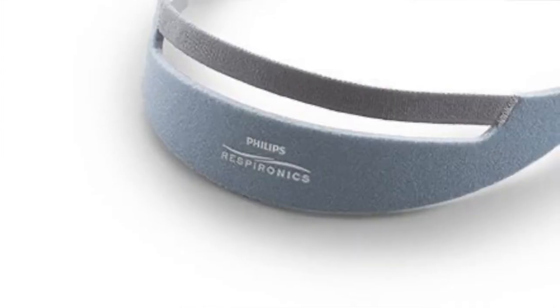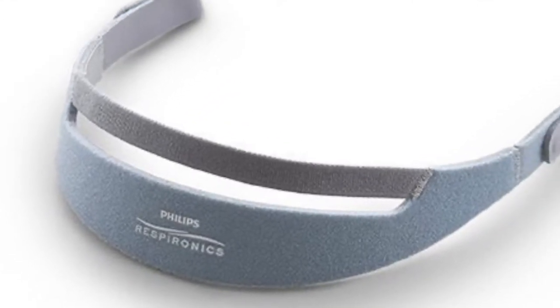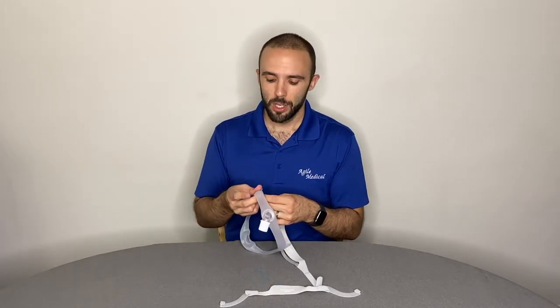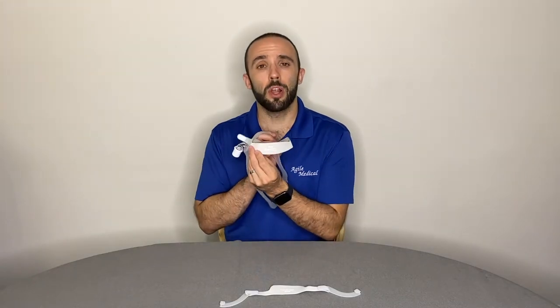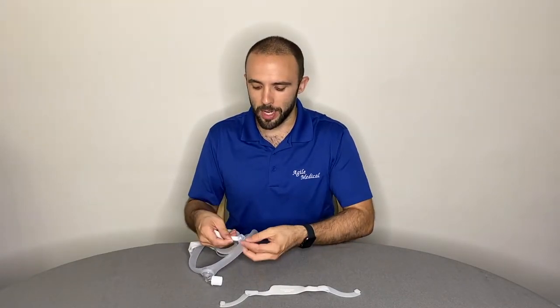Here's how it works. For the original model, simply slide the velcro tab through the slot on the side of the mask frame. Secure the headgear loosely at first and make sure that the Philips Respironics logo is facing outward and upright.